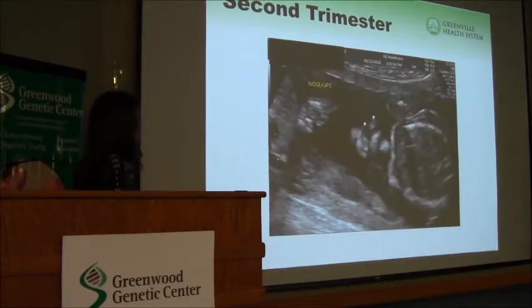All right, what about this one? This points to an area here, upper lip. Exactly. So you've got the lip here, you've got this defect right here, and then it continues. So that's the upper lip. So there's a cleft lip there. Again, associated with a number of different genetic abnormalities, as well as in isolation frequently that runs in families.